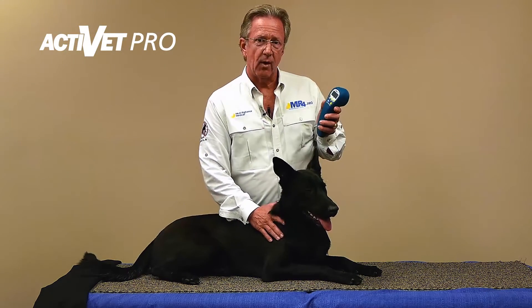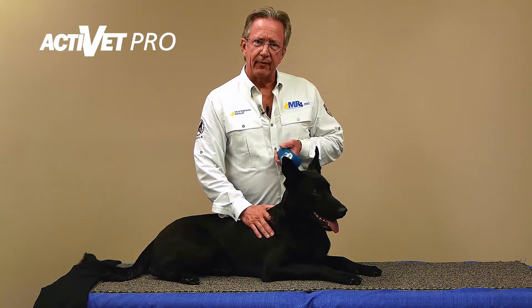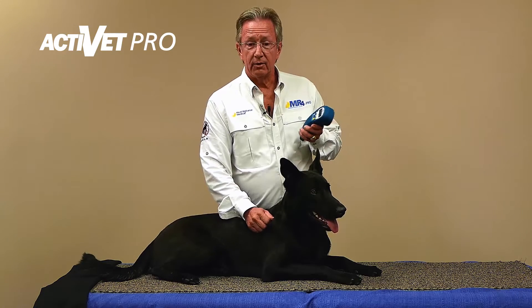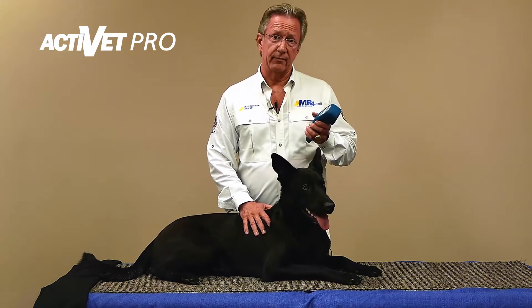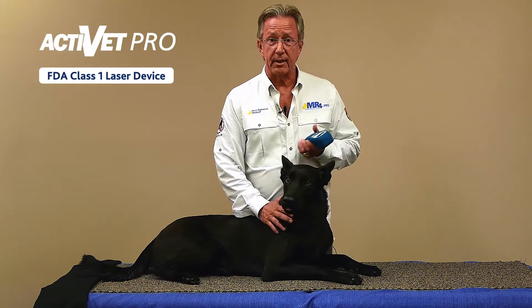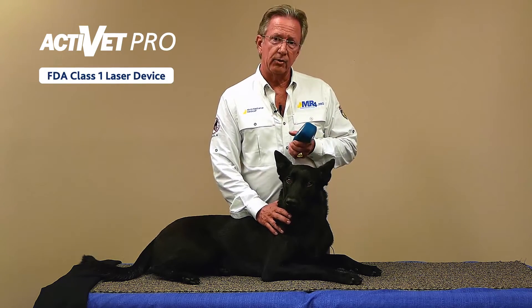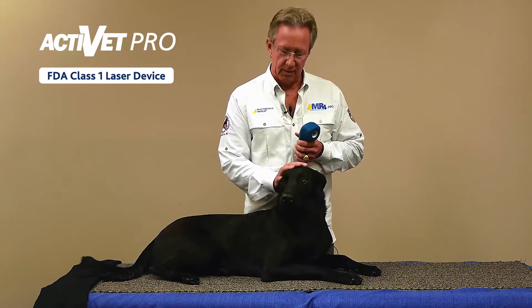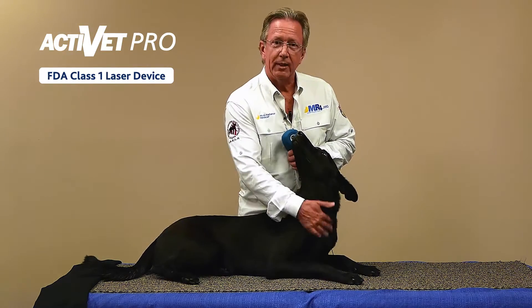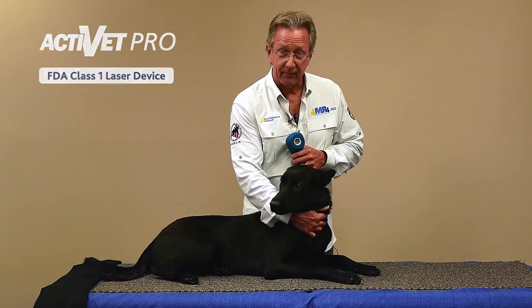This is 50 watts, but it's super pulsed, and that's a great safety factor you really appreciate because this is a laser that can be taken anywhere, used anywhere, because it's totally safe. It has a 1M FDA clearance, which is equivalent to over-the-counter safe. So it can be taken anywhere and used to keep your dog in fine condition right before an event.